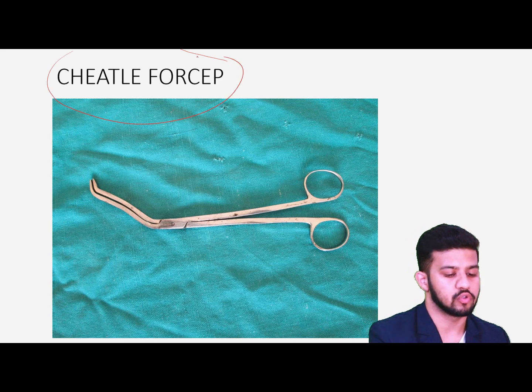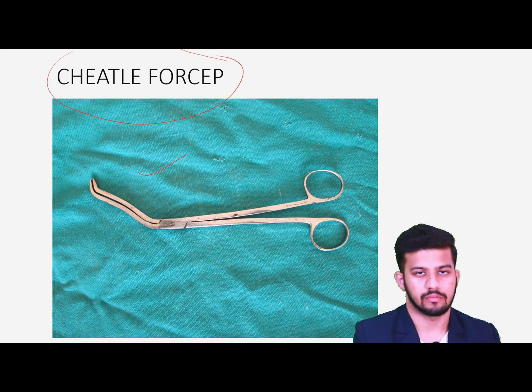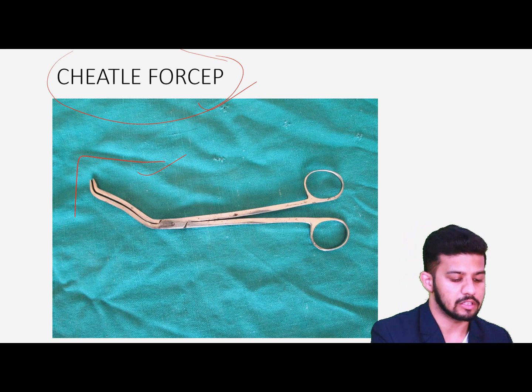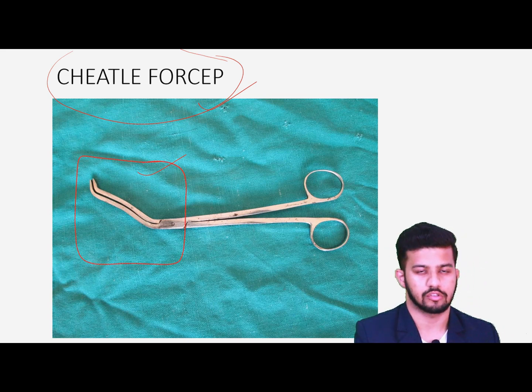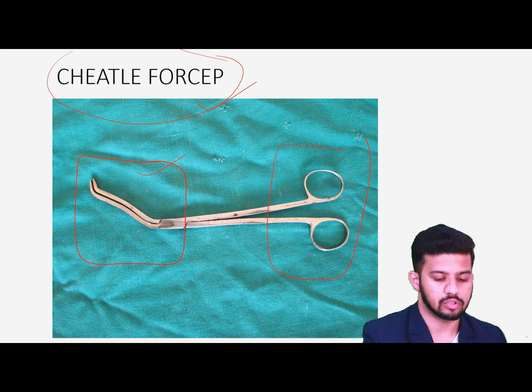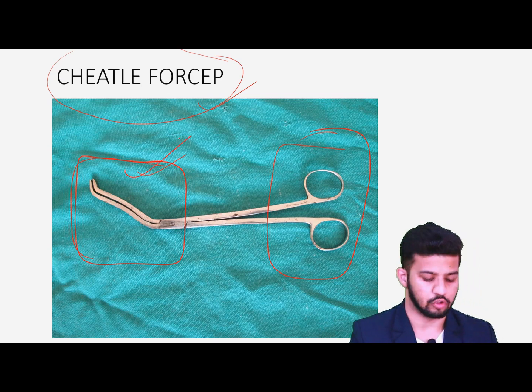This is the Cheatle's forceps, which you usually find inside your ward postings and ward rounds when the senior resident is doing dressings. They used to ask you to pass the forceps or dressing materials. The very important thing is that this lower part is sterile because it is usually dipped inside a glass bottle of sterile surgical solution. We never touch this lower part — we only handle the upper part.